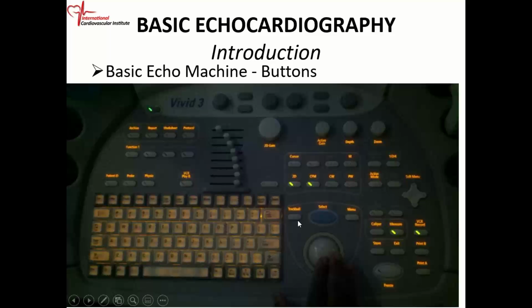You have to turn the machine on, so there should be a power button. Once you get to a machine, look for the power button, because you need to know how to turn it on and off. Not only that, you have to record what you're doing. So there is a button to record. So those are the basics.